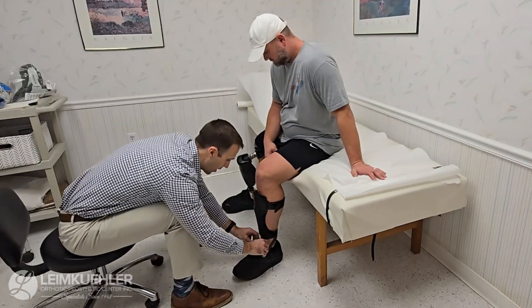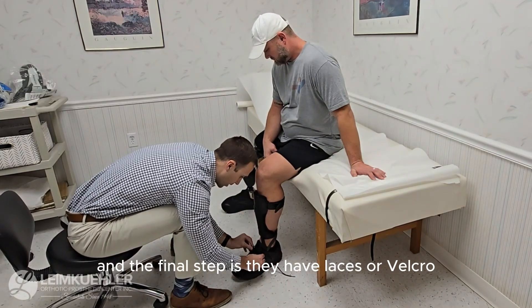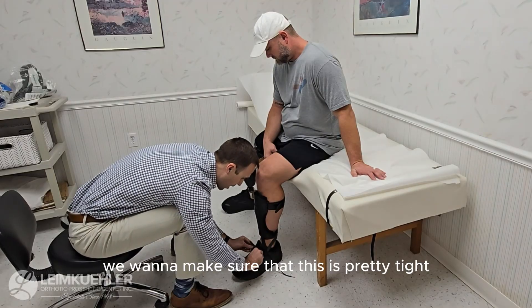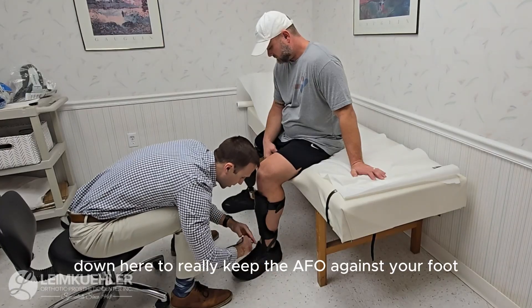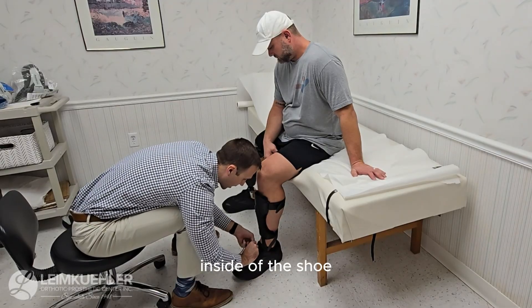They come very long and we would cut these based off of the person's leg length. The final step is, whether you have laces or velcro, tighten up the shoe. We want to make sure that this is pretty tight because we're using the shoe as another strap to really keep the AFO against your foot inside of the shoe.